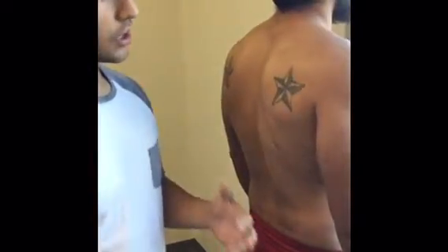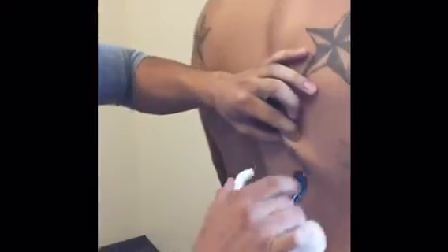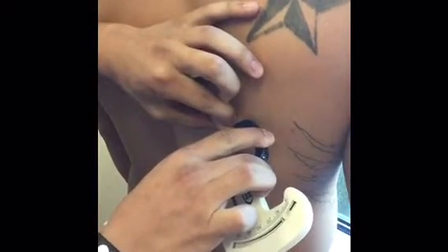Alright, so now we're doing the actual assessment of all 7 sites. We're going to start off right here with the tricep. We already have it marked up. We got a reading of 9. So with the arm up to the side, locating the inferior portion of the subscapular. Now let's take a diagonal fold. And we got a reading of 9.